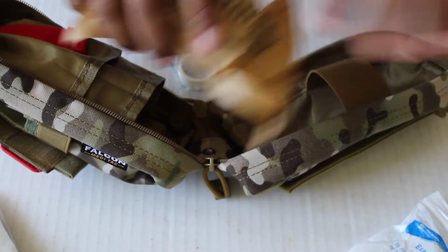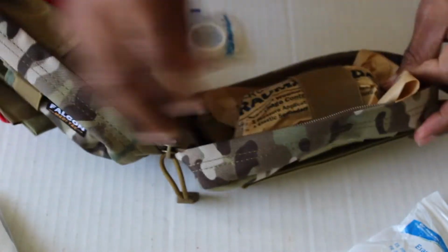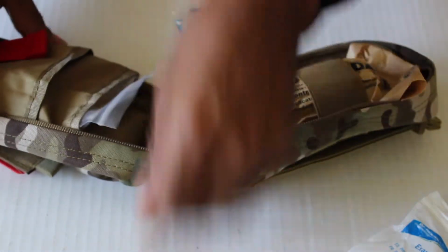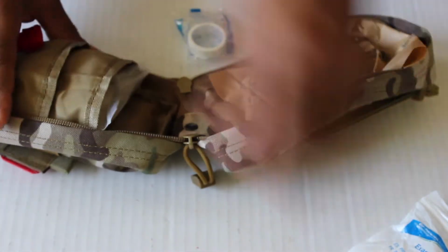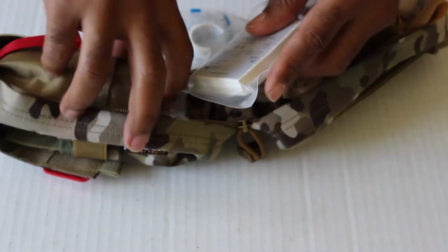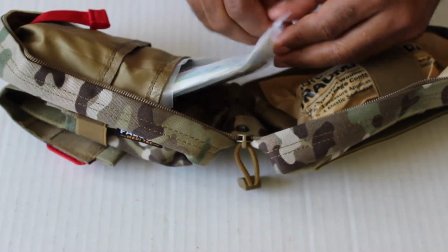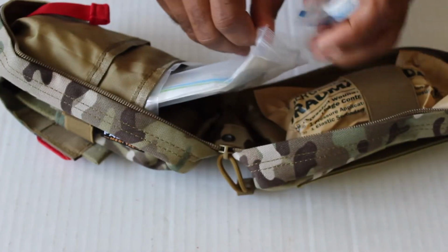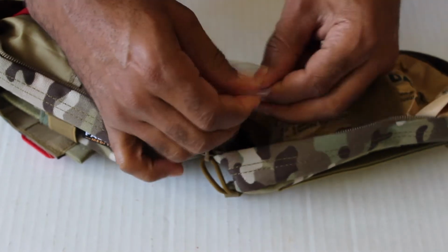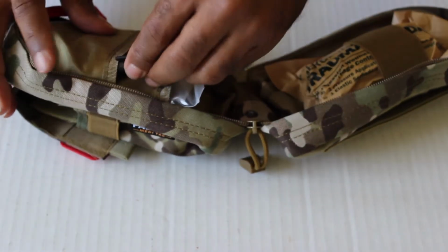So let's get this stuff back in there. See, I'll put it back in. Goes in fairly quick. I'm going to add something to it that did not come with it. A little ink marker back in there.